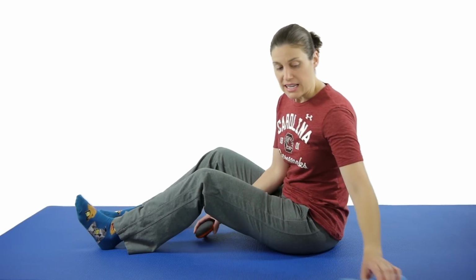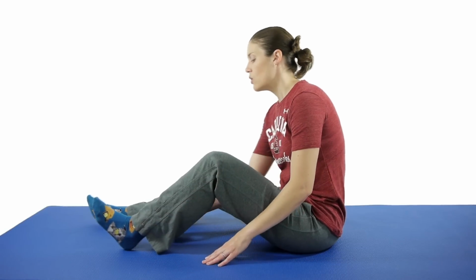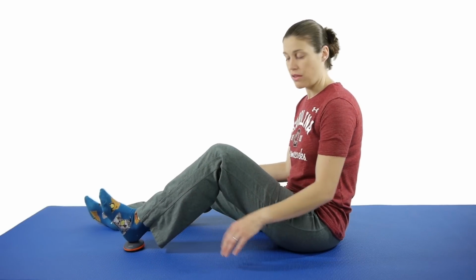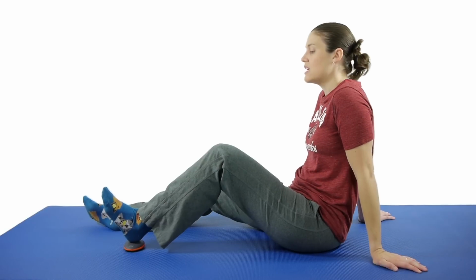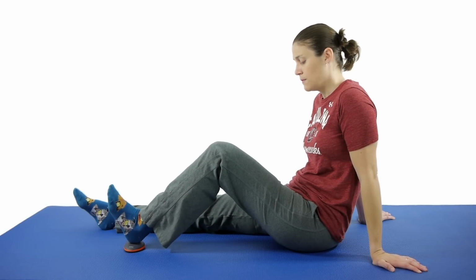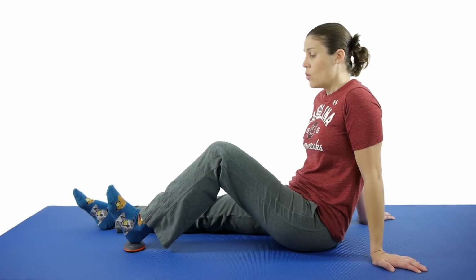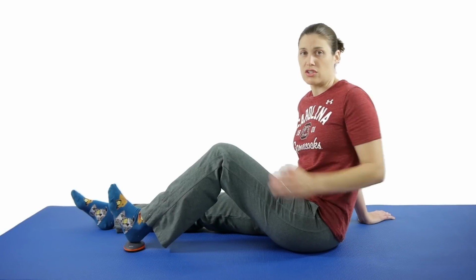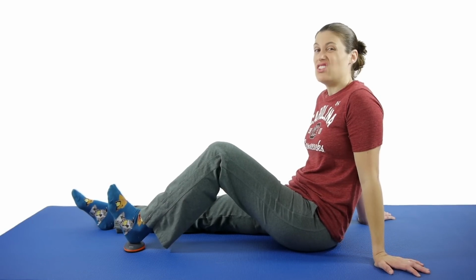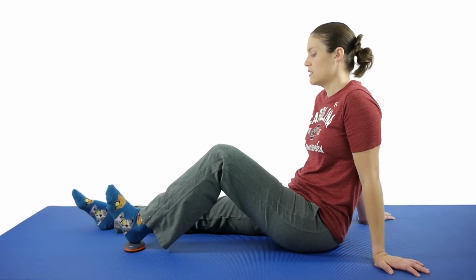The next one is going to be a hamstring set, and the way to do that pretty easily is bend your knee up and put your heel down on the floor. So again, I would just place my heel on the Active 5, and then you're pushing down, activating those hamstrings underneath. Again, you want to push as hard as you comfortably can for about 3 to 5 seconds, and then relax. What's really neat about this is you'll be able to track your progress and see how much you're getting stronger. Sometimes you think, I feel like I'm pushing the same, but then you can actually have visual results to see that you're getting stronger and pushing a little bit harder. So again, holding for 3 to 5 seconds and then relaxing.